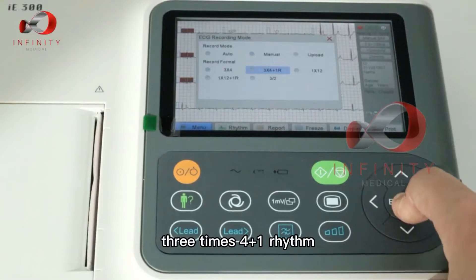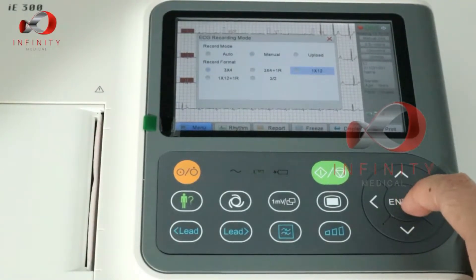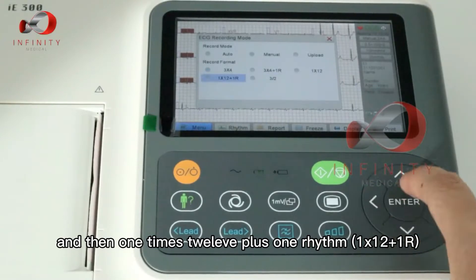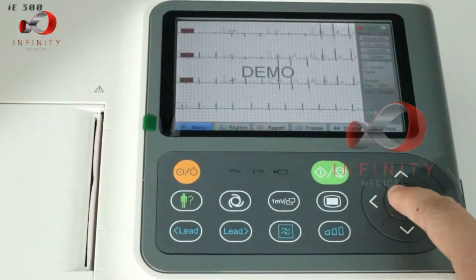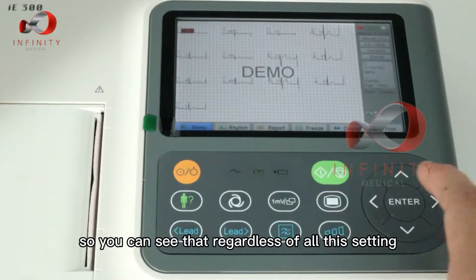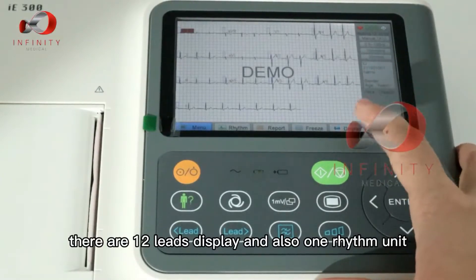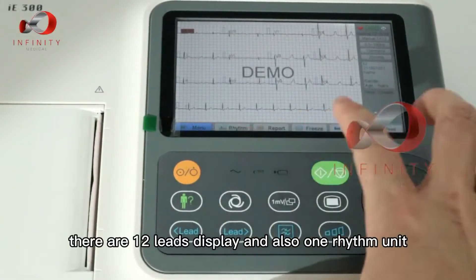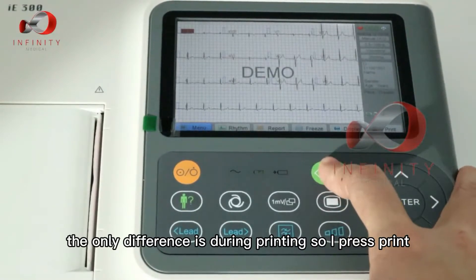The available formats are: three times four, three times four plus one rhythm, one times twelve, one times twelve plus one rhythm, and three over two. Regardless of the setting, the machine displays 12 leads and one rhythm unit — the only difference is during printing. I'll press print now.